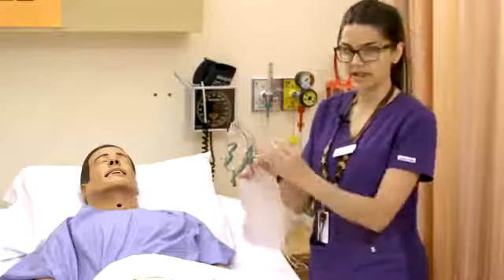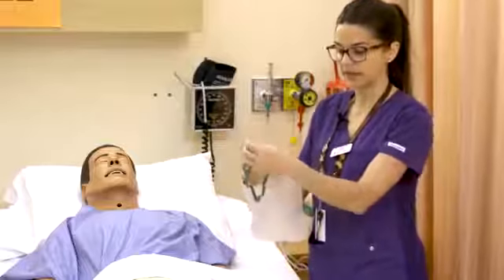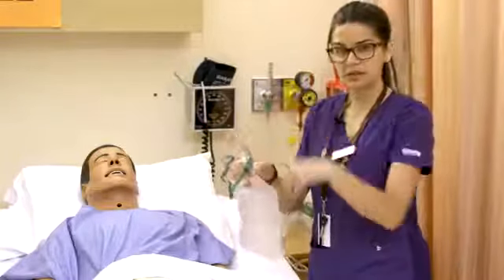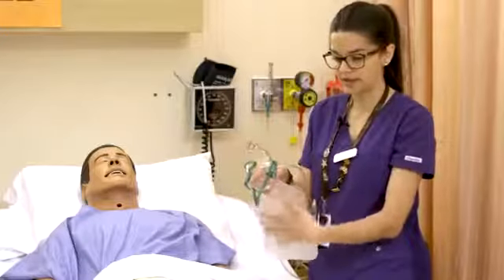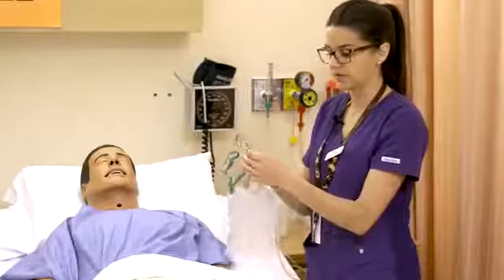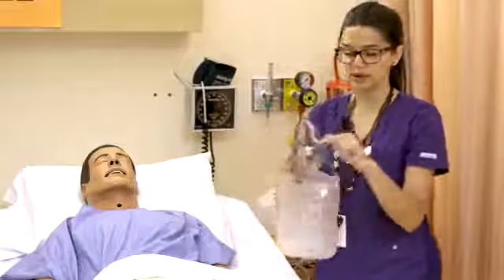So the person can suck the oxygen out of the reservoir bag because the valve lifts up and allows them to suck air out of here, but they can never breathe back into the bag. So they're never rebreathing their exhaled air from the bag because none of it ever enters there. And then we also put a valve on only one of these side ones.